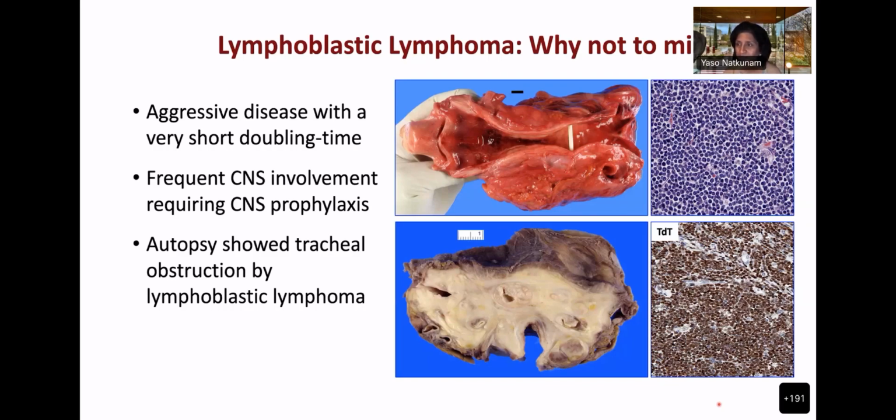There's another comment, ma'am, in the chat box. Dr. Soumya Ranjan Malik says that cytokeratin and P63 help. Sorry, I forgot that. Thank you so much. So if you have a true cut biopsy, which was the original question, the keratin mesh work in the background can be very helpful. Thymic hyperplasia versus thymoma also has differences in how the keratin pattern is in the background. So that mesh work can be very, very helpful to get to thymoma.